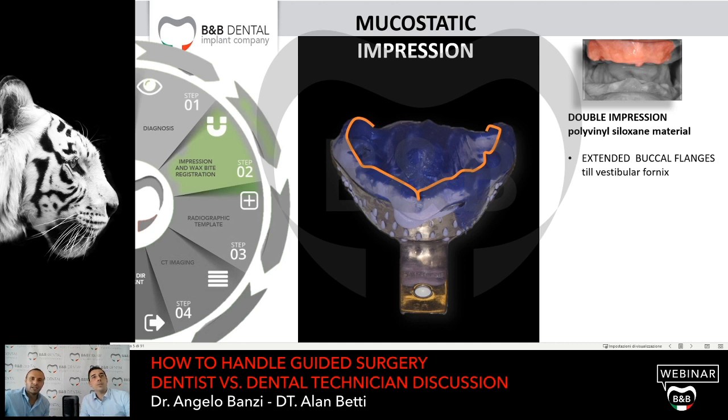has to do is to take the impression. Let's have some information about the type of impression that we have to take, because everything starts from the impression, we can say. And as you can see from this image, I use a double impression polyvinyl siloxane material.